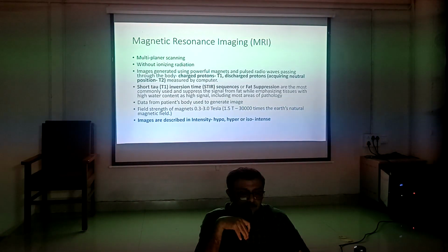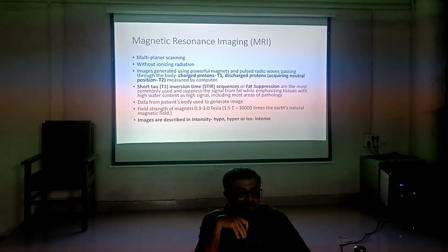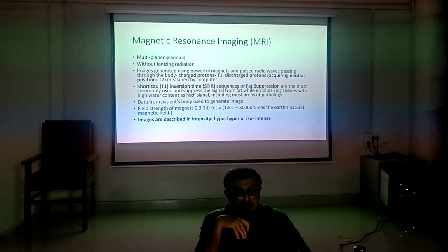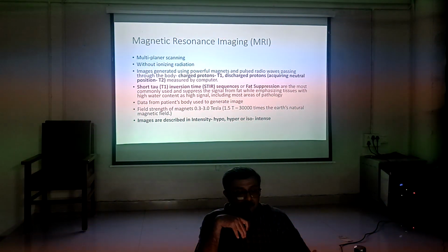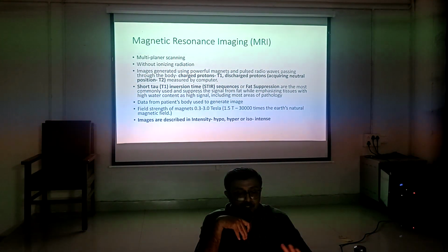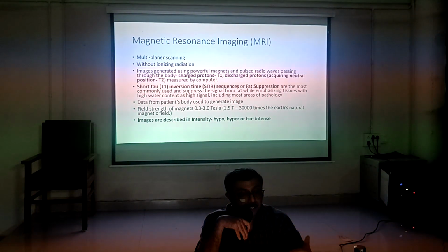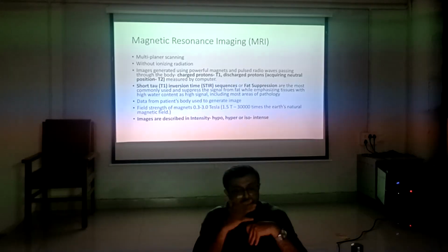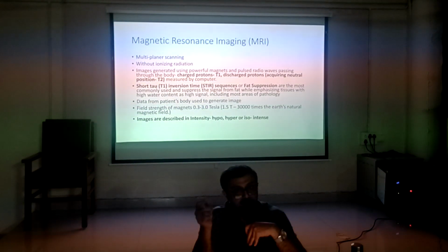Again, MRI. So what is the phenomenon? Images are generated using powerful magnets and pulsed radio waves passing through the body. Charged protons, T1. Discharged protons acquiring neutral position, T2. Right? So a magnetic field is there, a high active magnet.